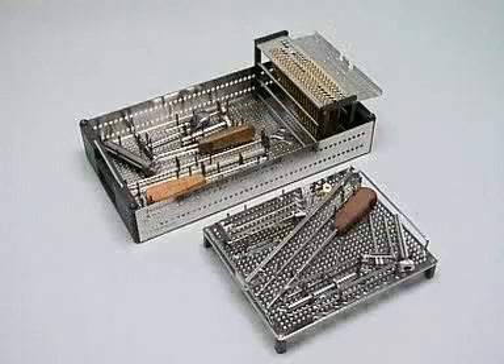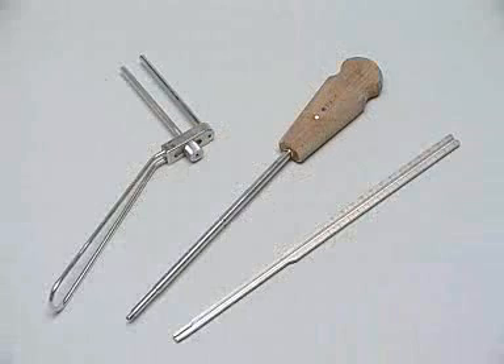Instruments and implants are stored in a special tray. For our exercise, we basically need only three instruments: a parallel wire guide where one sleeve is adjustable, a cannulated screwdriver, and the direct measuring device for wires from 2 to 2.8 millimeters.